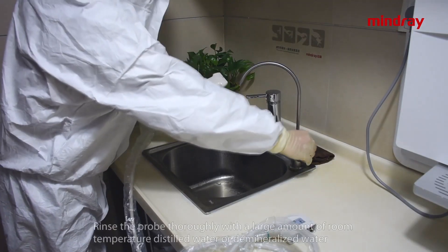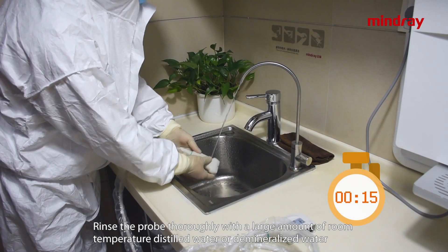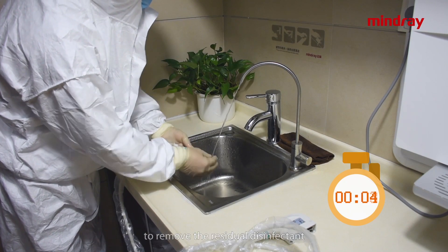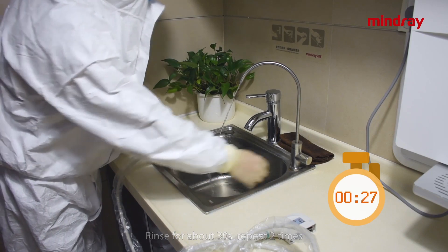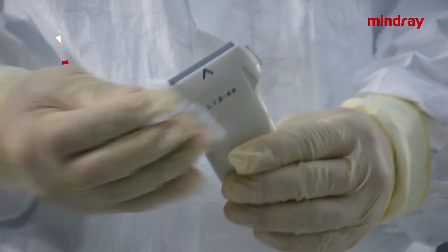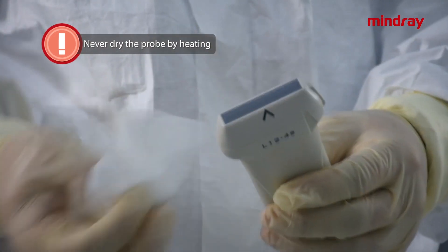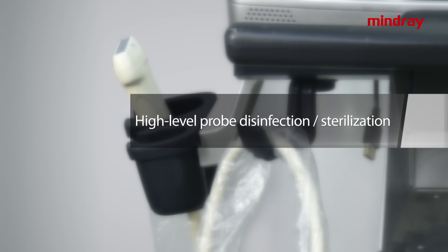Rinse the probe softly with a large amount of room temperature distilled or demineralized water to remove the disinfectant. Rinse for about 30 seconds and repeat twice. Wipe the moisture on the probe with a disposable soft lint-free cloth or paper towel. Caution: never dry the probe by heating.